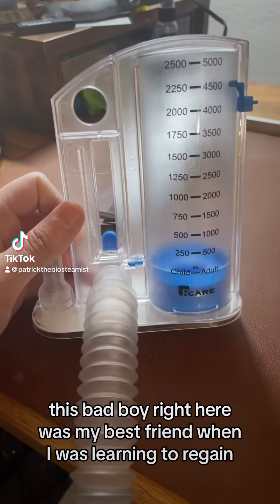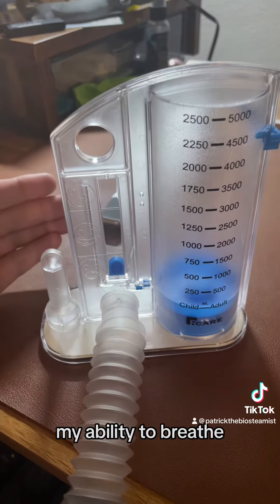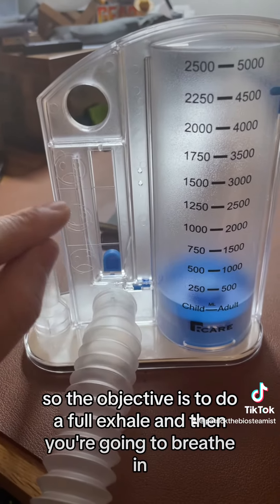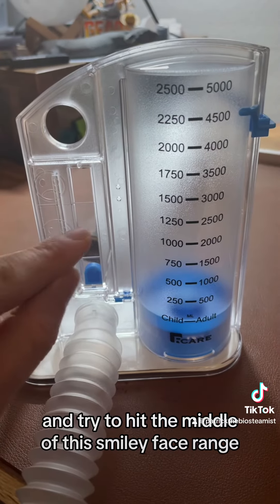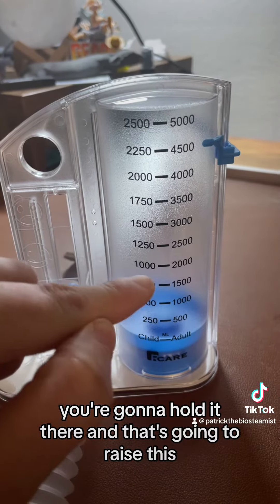This bad boy right here was my best friend when I was learning to regain my ability to breathe. The objective is to do a full exhale and then breathe in, trying to hit the middle of this smiley face range, and hold it there — that's going to raise this up.